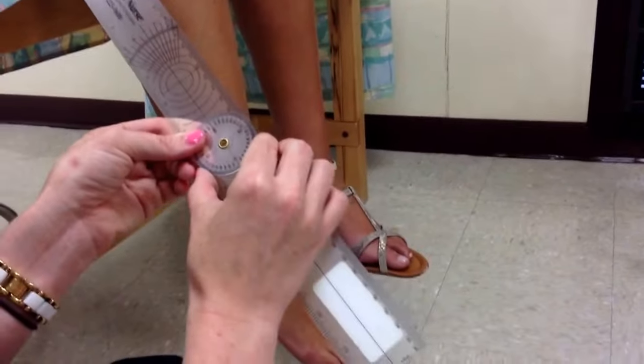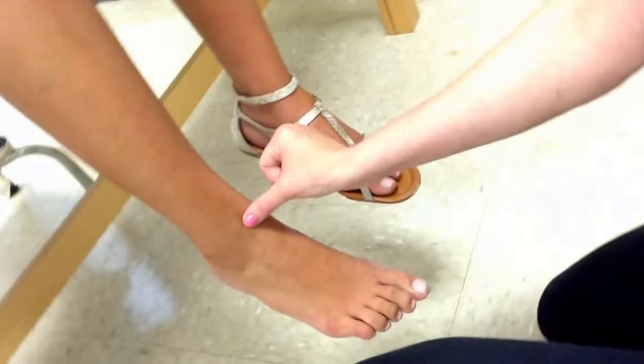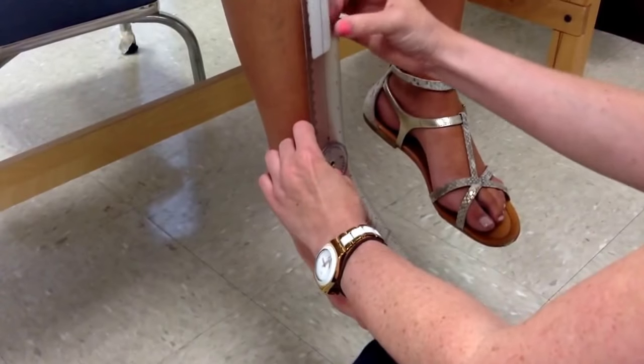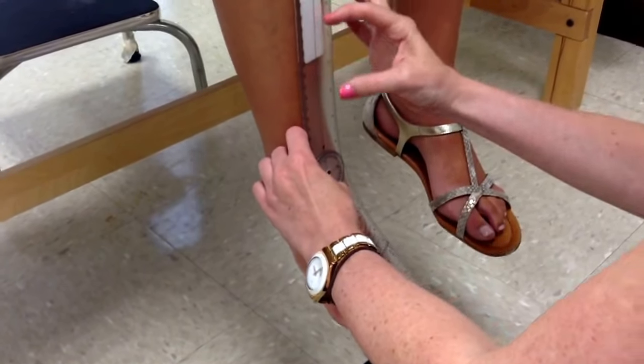For inversion and eversion, I'm going to come around to the front of the patient. The fulcrum is going to go right in between the medial and lateral malleoli. So right in between the medial and lateral malleoli, that's where the fulcrum is going to go. The stationary arm is going to line up with the tibial crest.